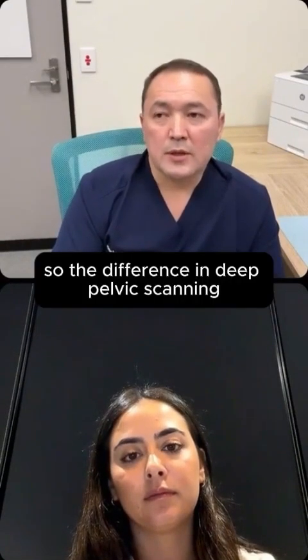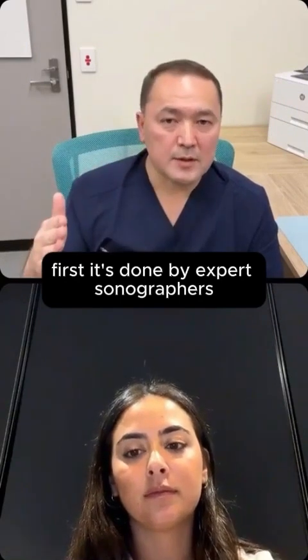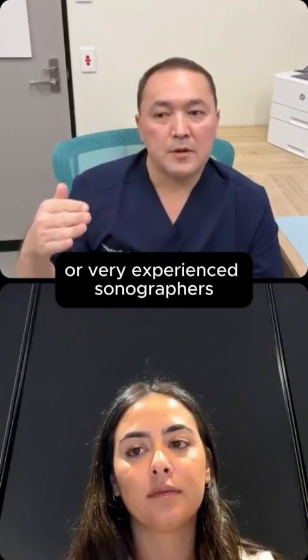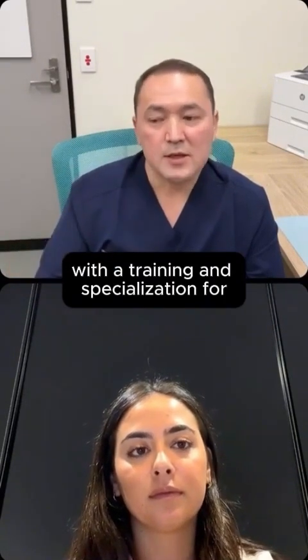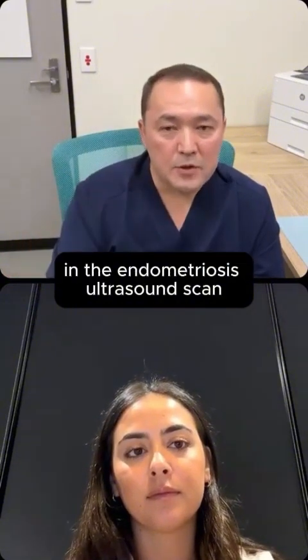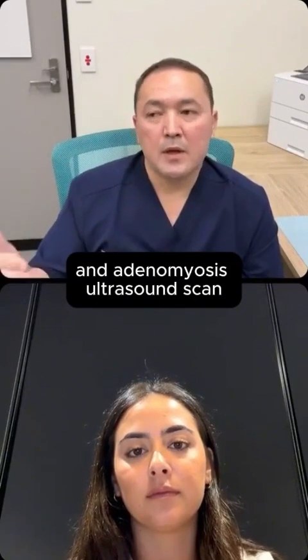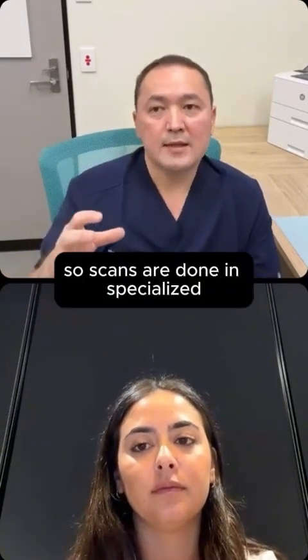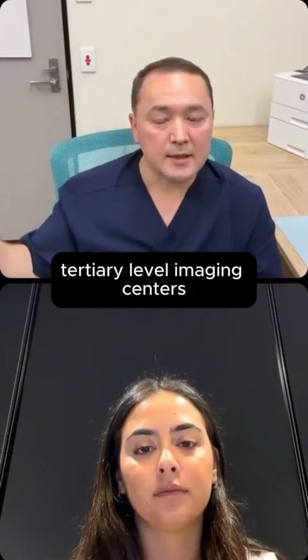examination. So the difference in deep pelvic scanning, first, it's done by expert sonographers. Usually they are gynecologists or very experienced sonographers with training and specialization for endometriosis ultrasound scan and adenomyosis ultrasound scan. This is the first requirement. Second, usually these scans are done in specialized tertiary level imaging centers.